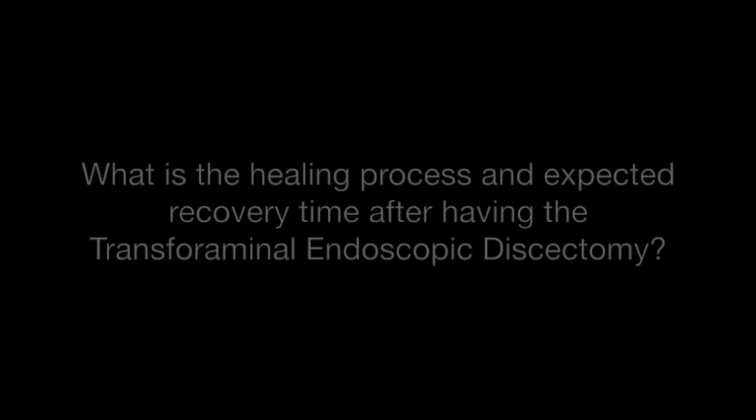So with any discectomy, no matter how it's done, there is a risk of recurrent herniation. That is somewhere between 5 to 10%, no matter how it's done. The advantage of an endoscopic discectomy is if you do have a recurrence, it can typically be accessed through the endoscope a second time with, again, less morbidity than having the open surgery done the first time.